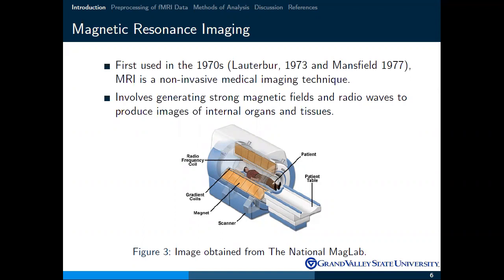And it's able to do this by generating a strong magnetic field and using radio waves to produce images of these internal organs and tissues in the body. So here's a depiction of an MRI scanner. So they're very large machines and very loud. That's not the best thing in the world, but again, nothing needs to be injected, and there's no long-term known effects from undergoing an MRI.